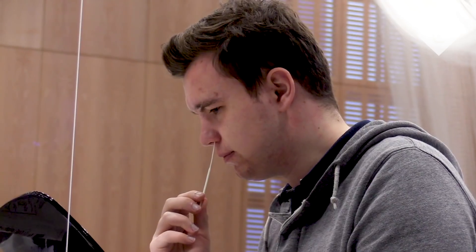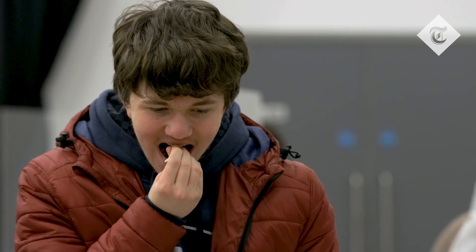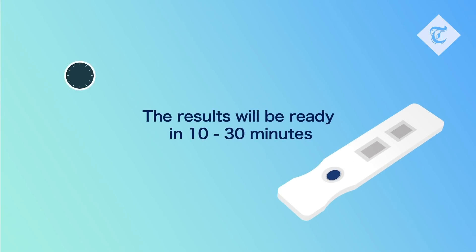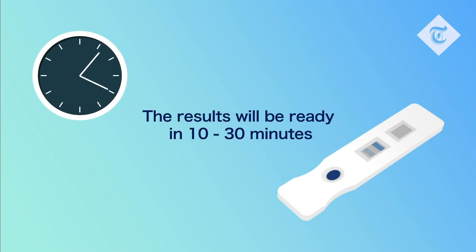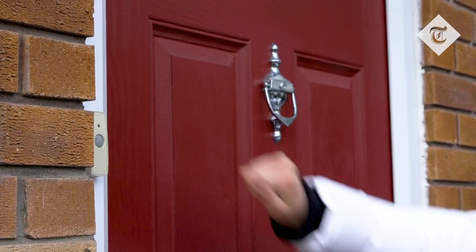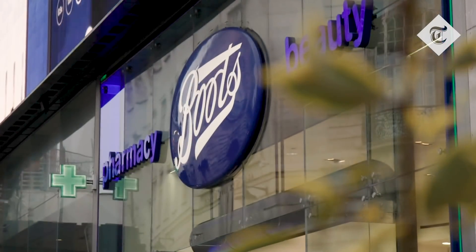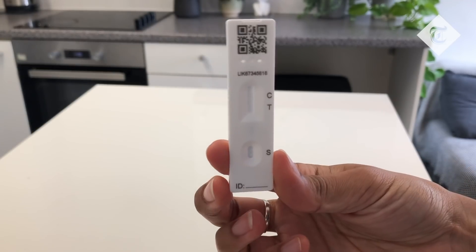Lateral flow tests are quick and simple coronavirus tests. You can do them at home even if you have no symptoms, and you can get the results in 30 minutes to see if you have COVID-19 or not. You can order them free online to be delivered to your home, or you can get them via your local council or from participating pharmacies. Here's how to carry one out.